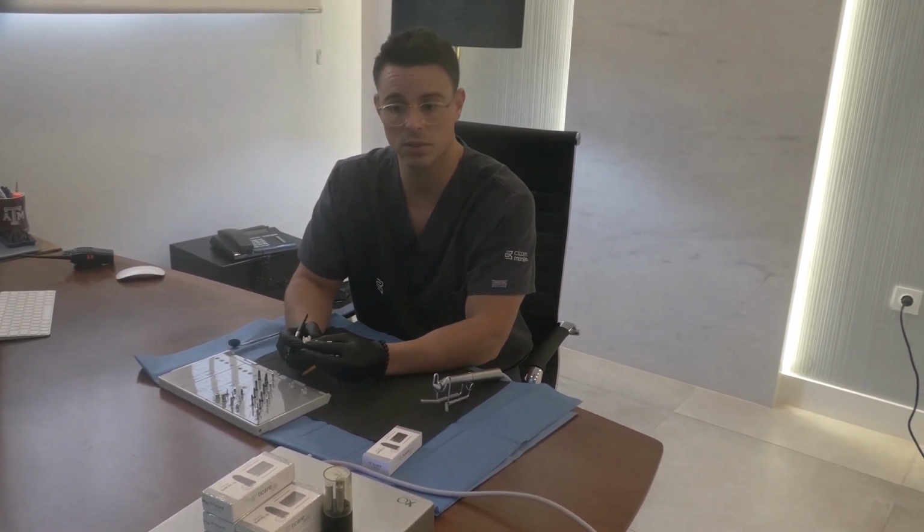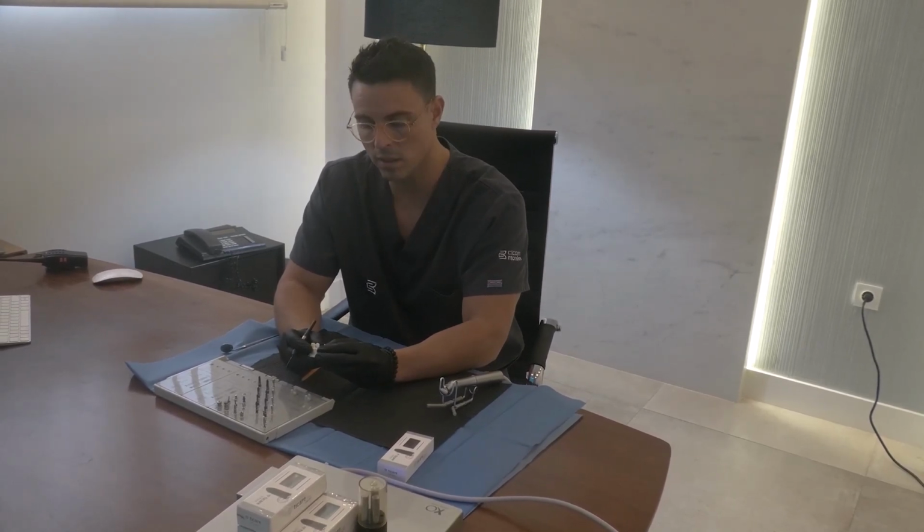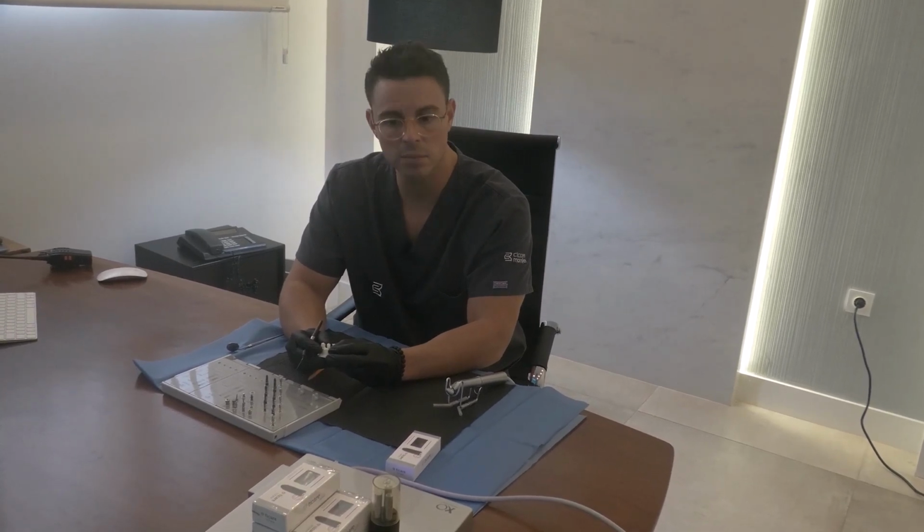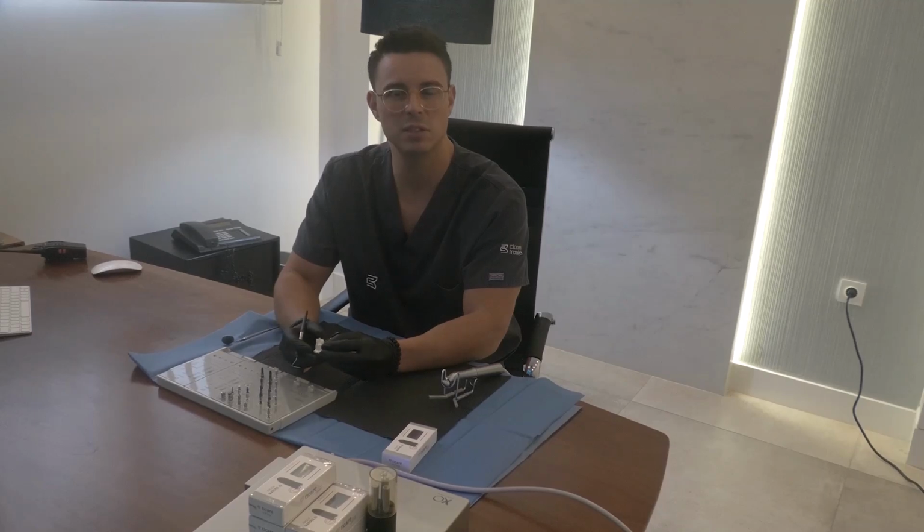maintained, and in those scenarios where a critical buccal bone thickness of 1.5 millimeters or 2 millimeters, which refers to the thickness of the cortical bone, cannot be guaranteed, simultaneous guided bone regeneration has to be applied. It is not recommended to go too far palatally, otherwise the emergence profile will be challenging to restore. In the apicocoronal direction, the implant is advocated to be placed at least 1 millimeter apically or subcrestally compared to the crest, never trying to exceed about 5 to 6 millimeters from the adjacent cemento-enamel junction.